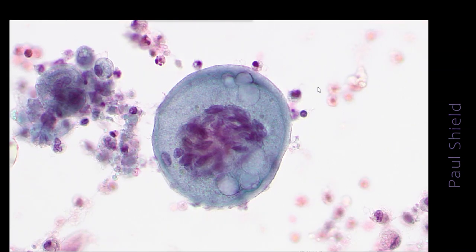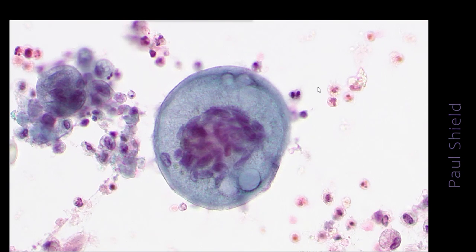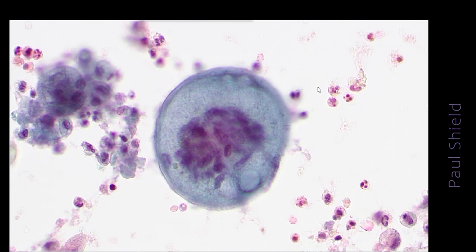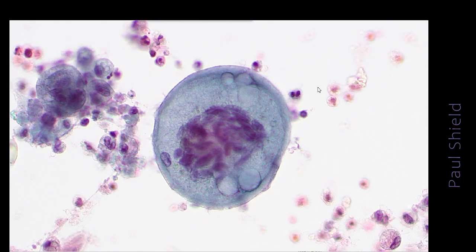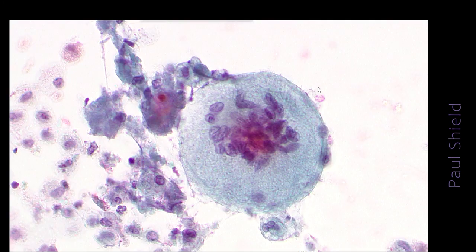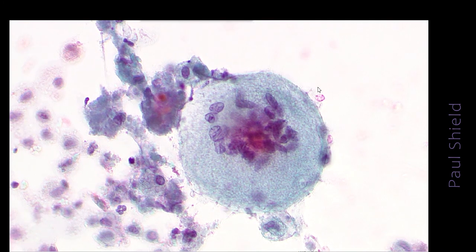Here's a nice giant cell. You can see it's got interesting cytoplasm with sort of foaminess and vacuolation and maybe some material inside it, and then a lot of nuclei that are all quite similar. Typical histiocytic macrophage type cytoplasm there.